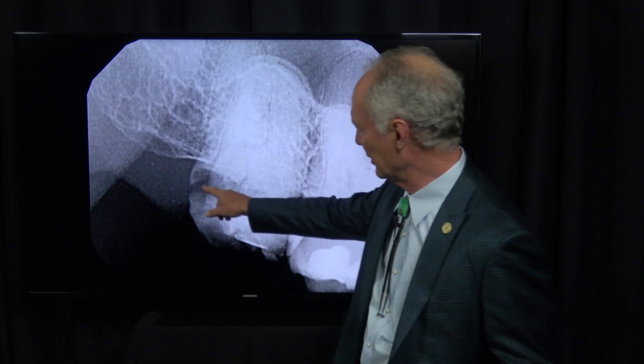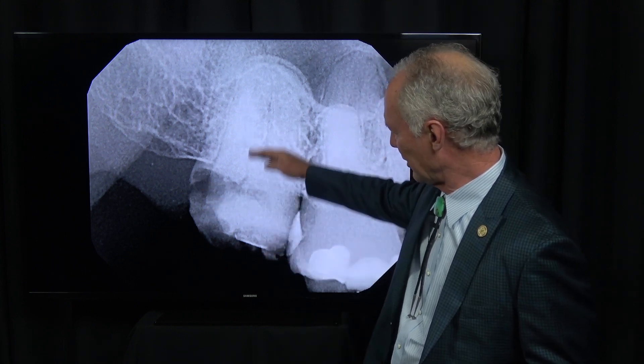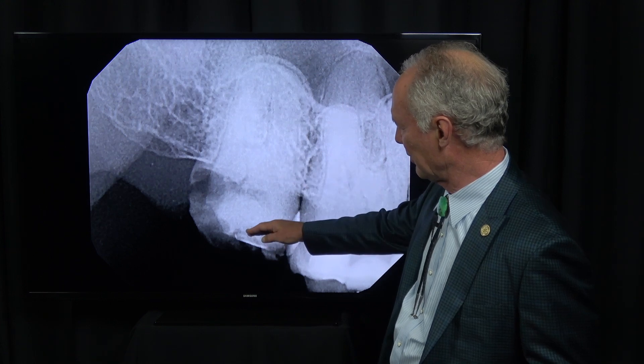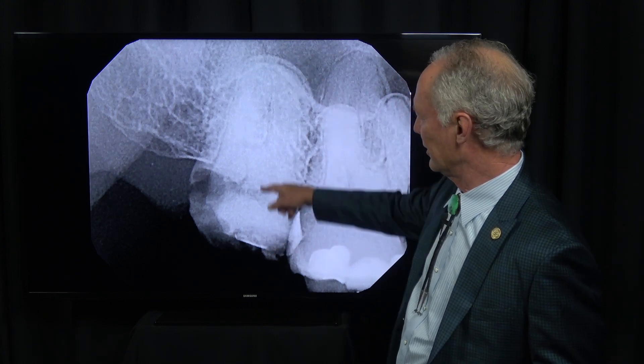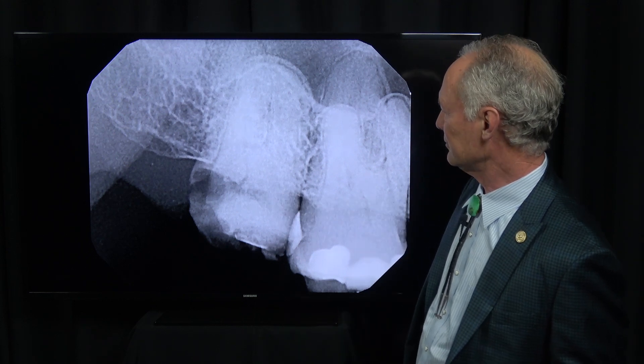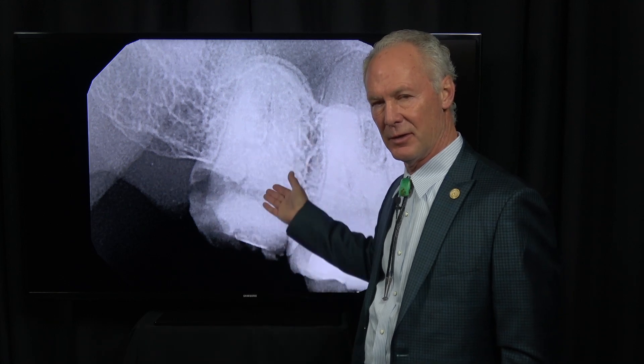You can see this second molar has been undermined with decay, so the coronal part of this tooth is probably going to come off, break off. Then we've got to remove the roots, and we also want to graft the socket because we want to leave the option of an implant open if we want to do that in six months once the graft heals.